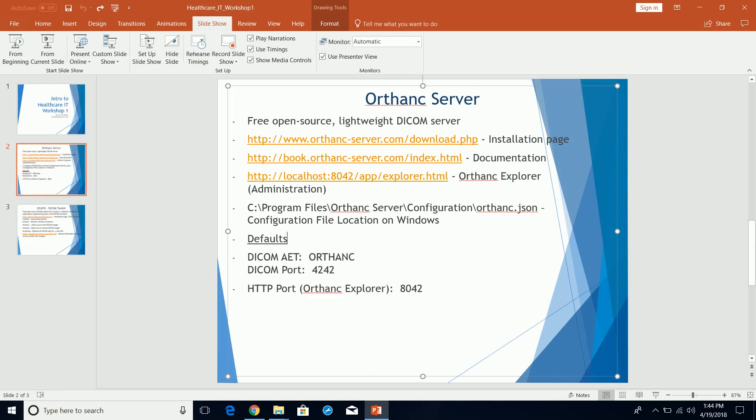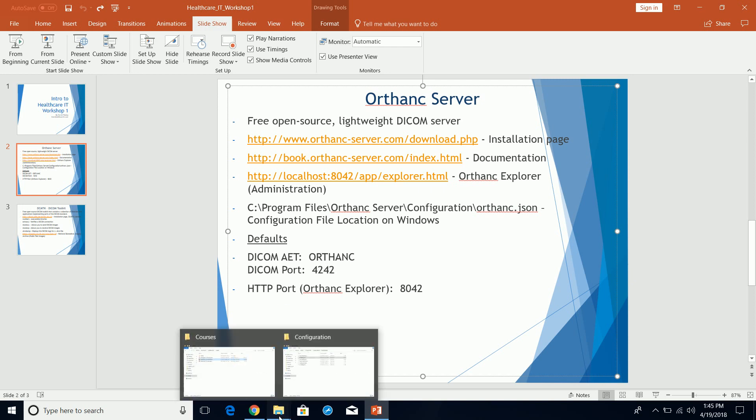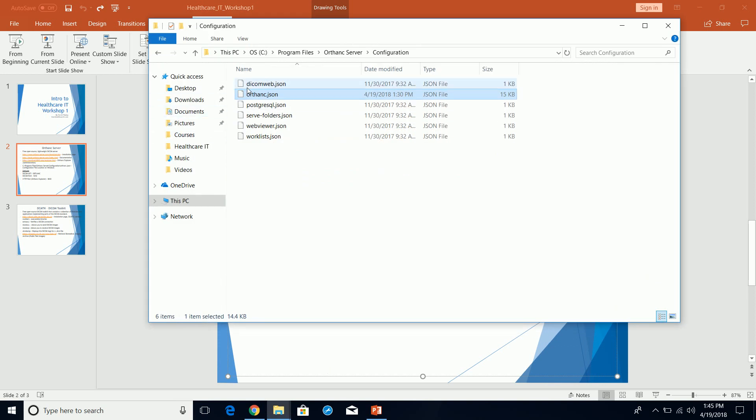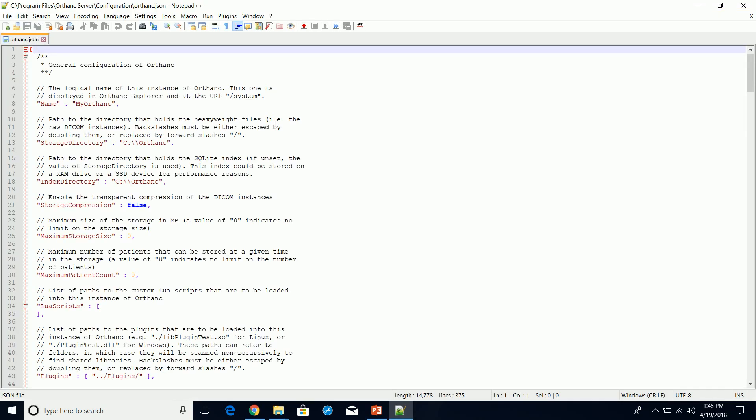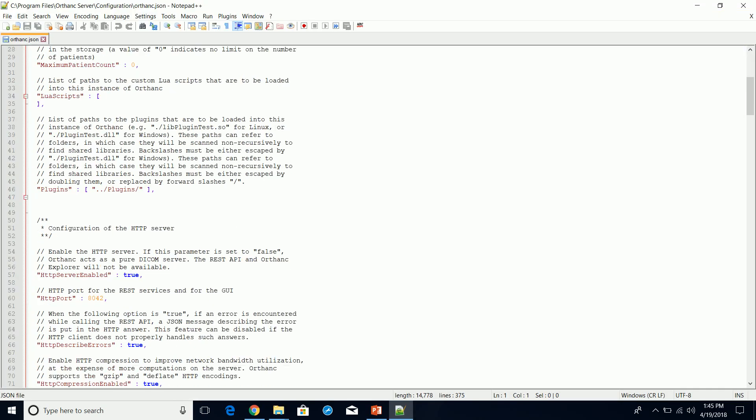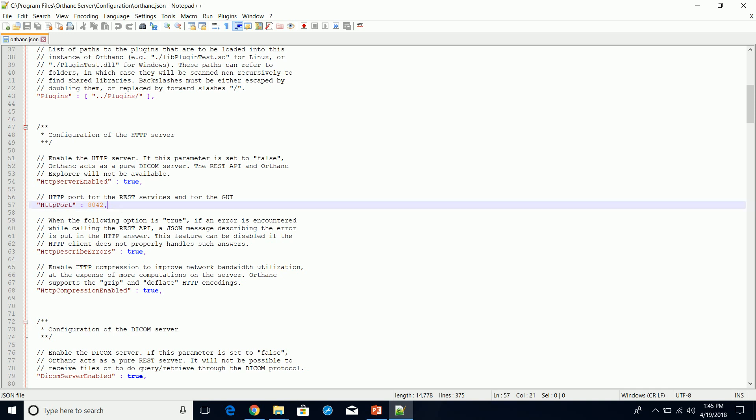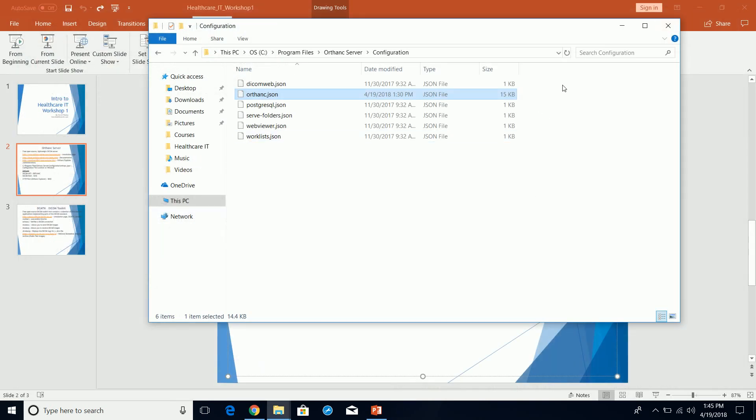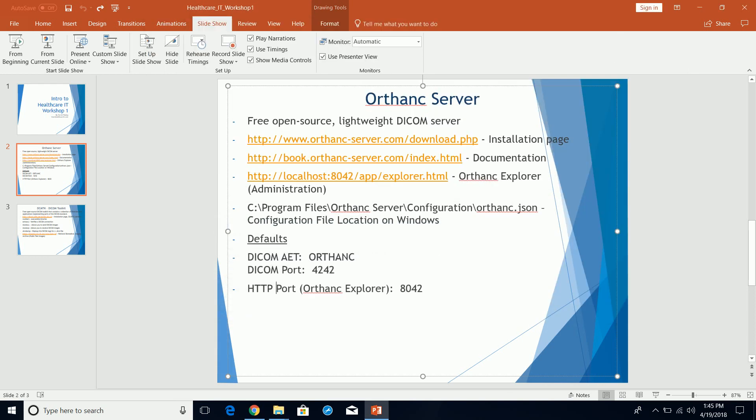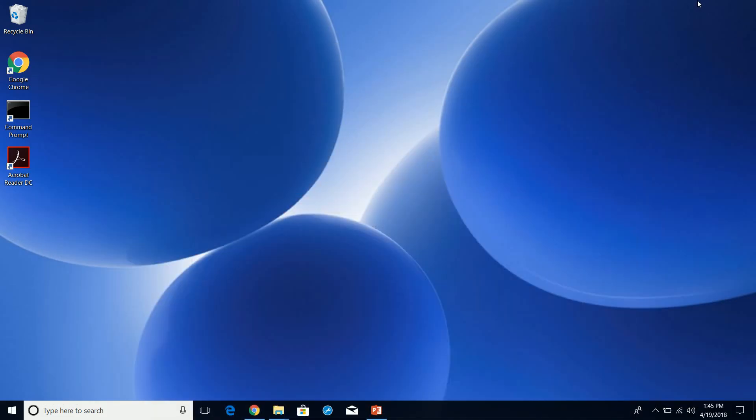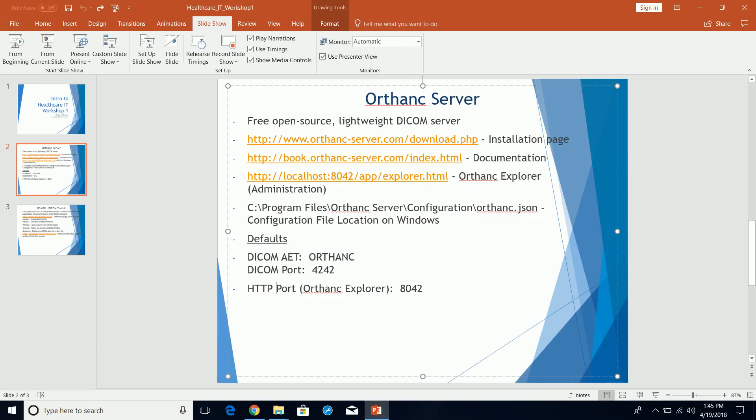You also have the HTTP port where the Orthanc administration page listens on. You can change that port too as well. So that concludes just the general install of Orthanc, your DICOM server install, also installing Notepad++, and knowing where the actual configuration file for Orthanc server lives. That's it with that, and we'll continue on with future videos. Thank you.